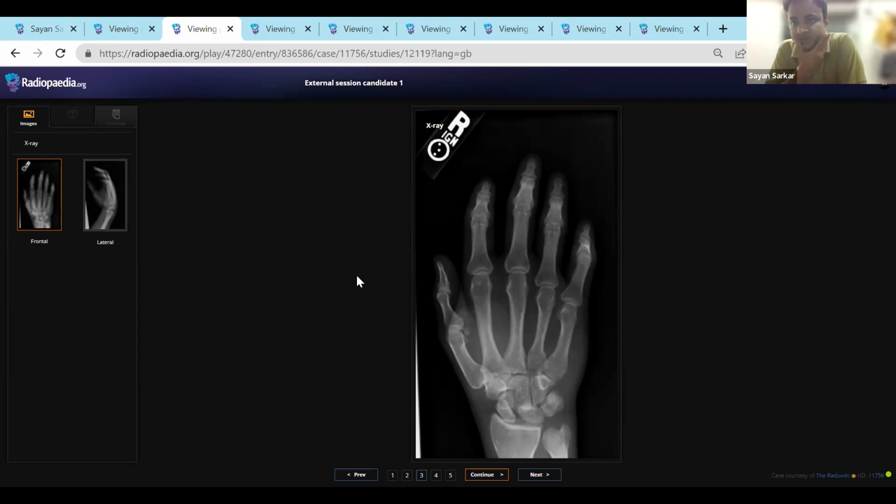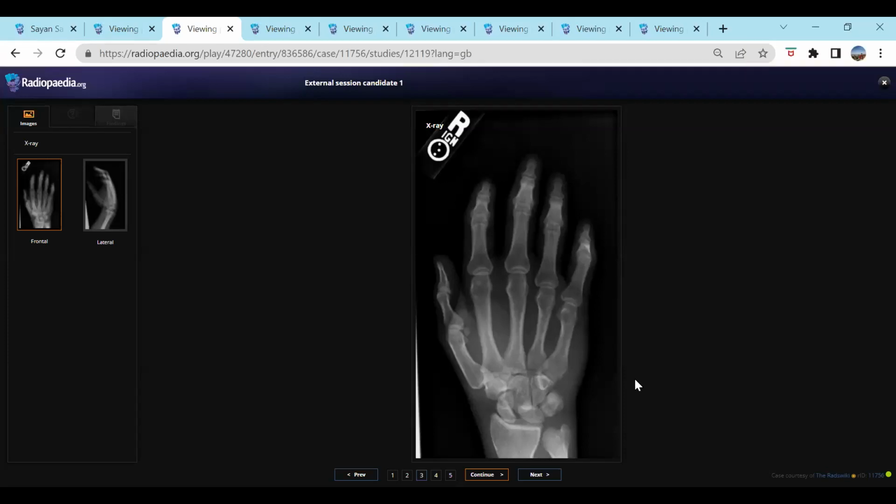So, what are you suspecting? What is your thinking process right now? Hello? Can you hear me? Hello? I think we lost Dr. Yusuf. Oh, okay. Is she there? Can you hear me? Yeah, I can hear you. Were you able to get my question, or should I repeat it? Please repeat it. I didn't hear you. Yeah, I just said, what is your thinking process right now? What are you trying to rule out one by one?